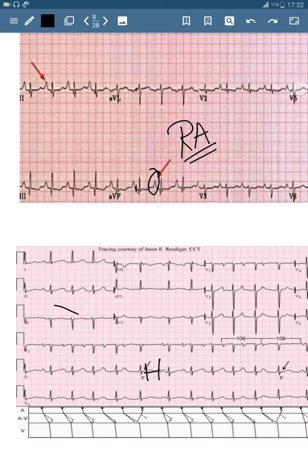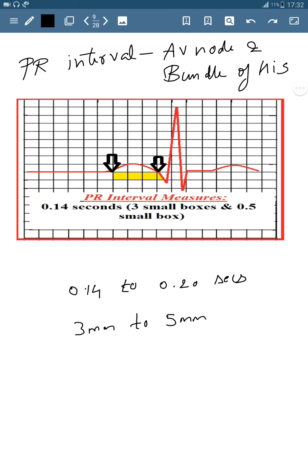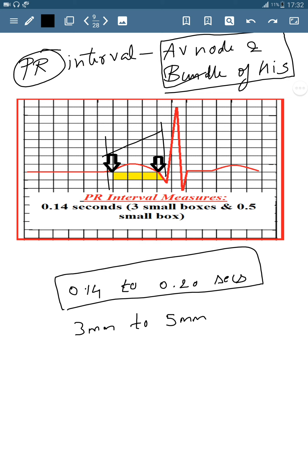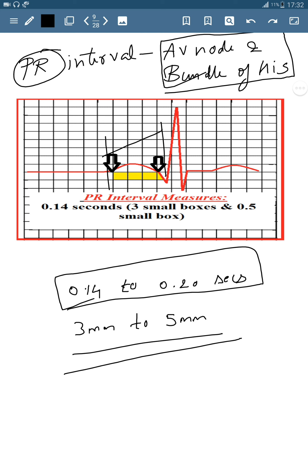Next, let's discuss the PR interval. The PR interval reflects AV node and bundle of His depolarization. The normal PR interval duration is 0.14 to 0.20 seconds, which corresponds to 3 mm to 5 mm in width on ECG paper.